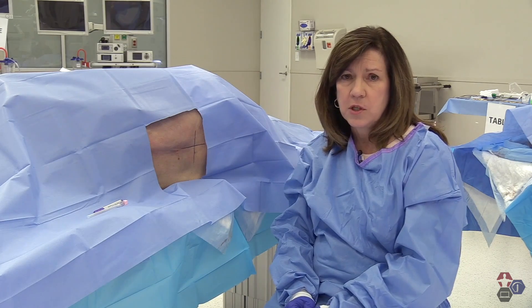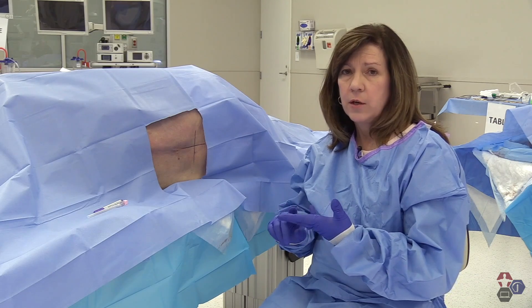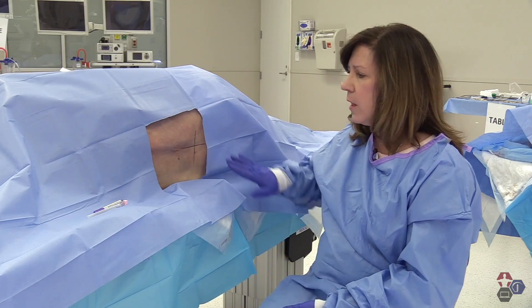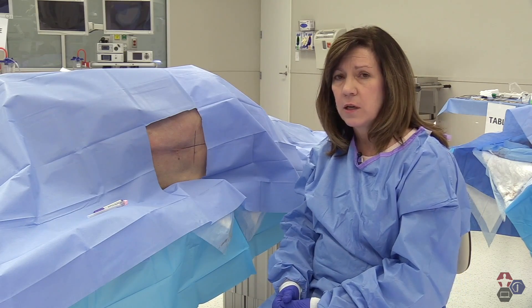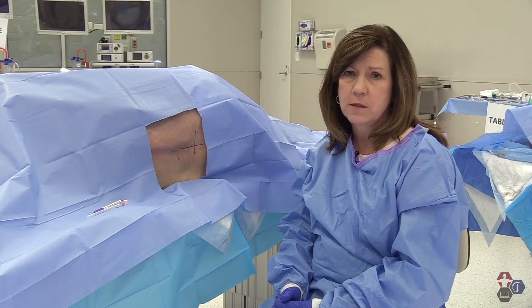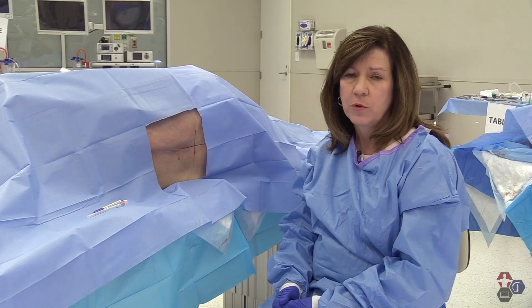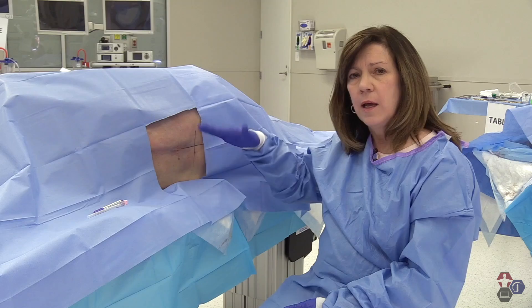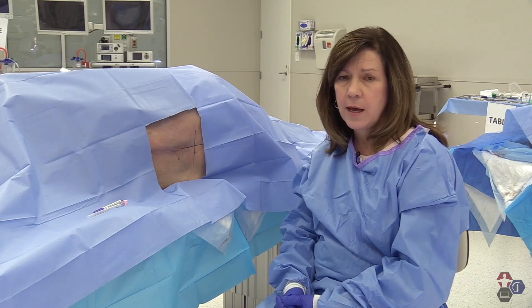The risks of this procedure include bleeding, infection, and nerve damage. Regarding bleeding — there aren't any major vascular structures overlying the midline of the lumbar spine at this area, but obviously there are cutaneous venous structures, as well as an overlying plexus of venous structures on the dura. We prevent bleeding by applying pressure after the puncture is completed and asking the patient to lay flat on their back.